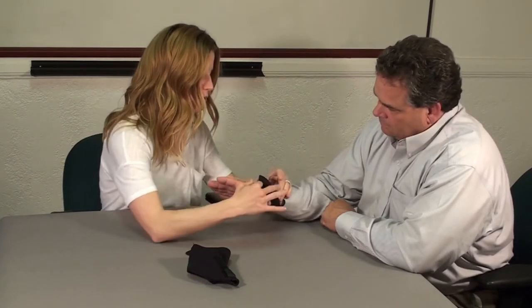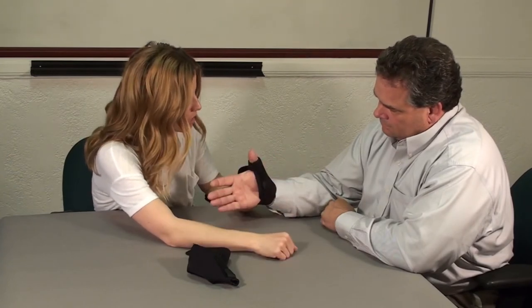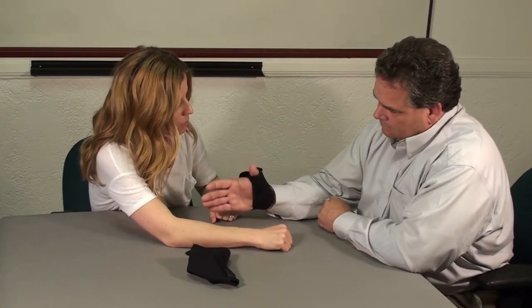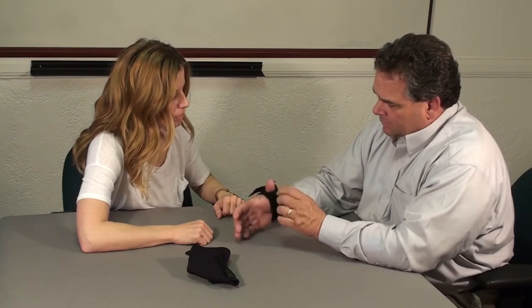You could trim your strap there — very simple design. You can have it as restrictive or unrestrictive as you choose by playing with those stay pods. What do you think of that one? I like this very much. Between the two, do you think there's something you could use? Some cases I need all three stays, and other cases I may just need this single one.